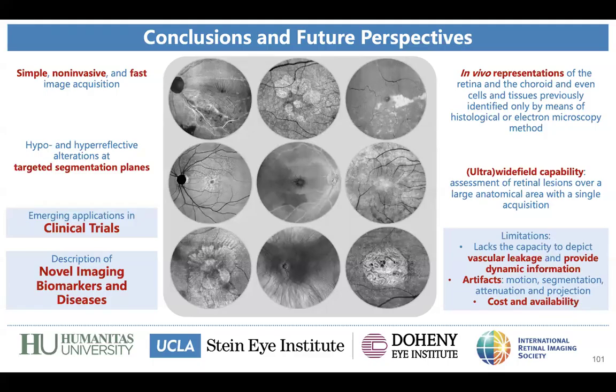There is some new technology for OCT devices, and Heidelberg has the HD OCT that, I'm not sure, but I think they have 2.2 micron axial resolution. Also, we have some researchers using the visible light OCT that states that they have 1 micron axial resolution.